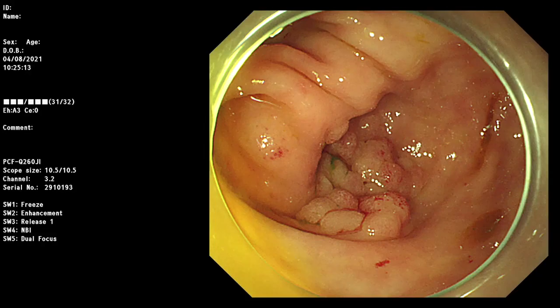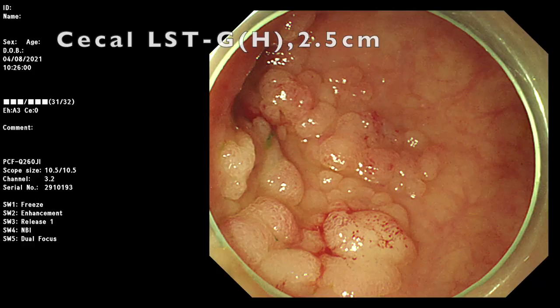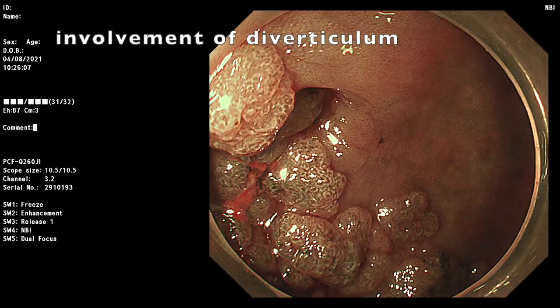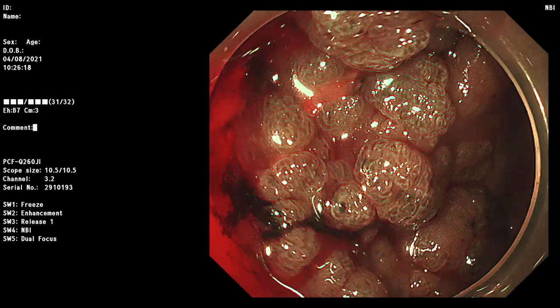This is a 2.5 cm laterally spreading tumor, granular homogeneous type, over the cecum involving the diverticulum. The JNET classification was type IIa, without invasive cancer. So, ESD was indicated for en bloc resection.